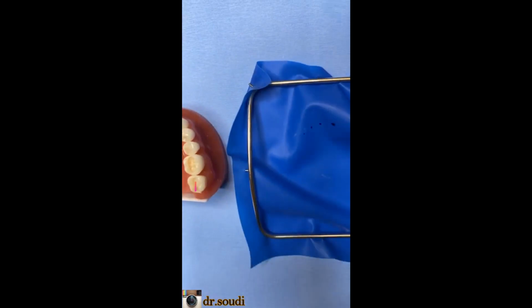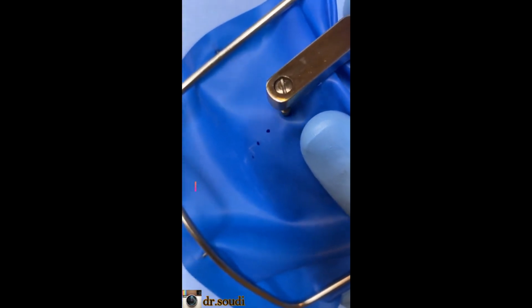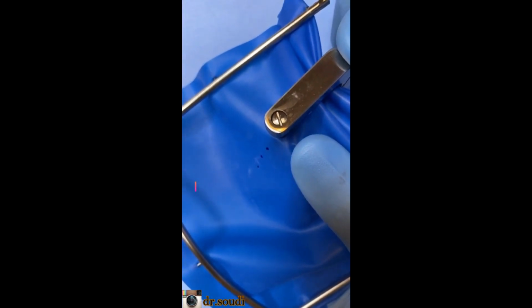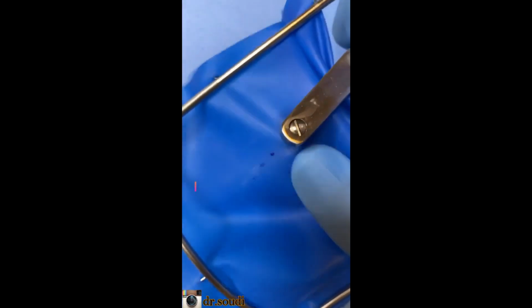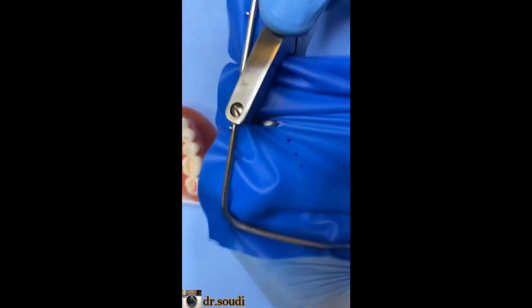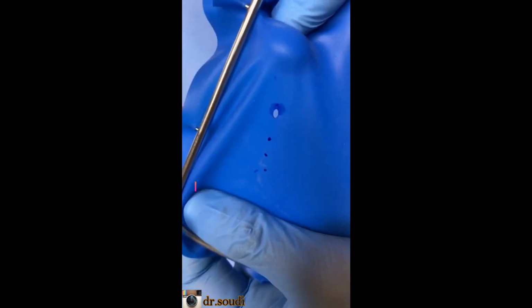Now we have 4 marks. We should do punch like we said, one for the molar. This is the molar, the anchor tooth which will have the clamp like this. Okay, as we said, free your sheet like this, free it, okay, until you get a uniform hole.